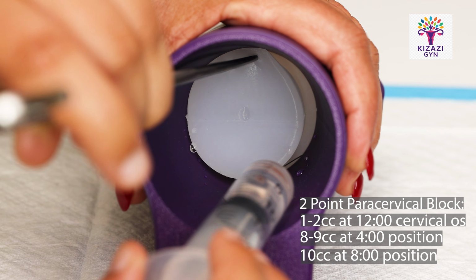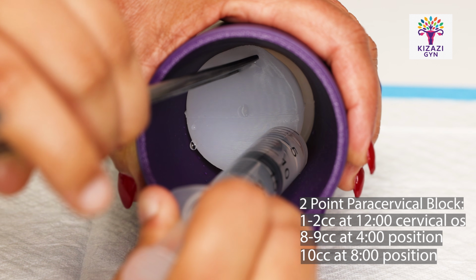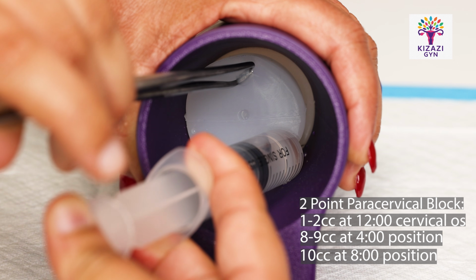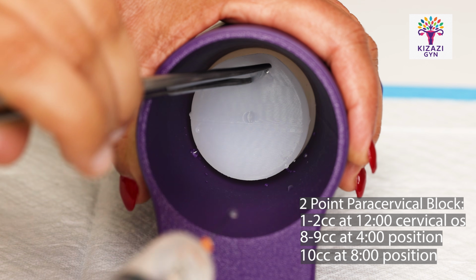Next, you're going to use the tenaculum. You're going to move that cervix to the other side to get to the 4 o'clock position. Once you get there, you're going to aspirate, and then you're going to inject. And you know that you're in the right spot because you're able to inject that fluid. And then you're going to come right back out.